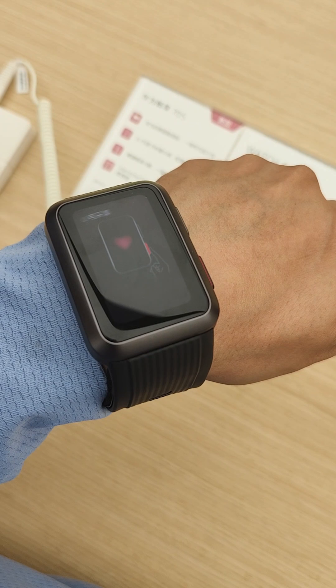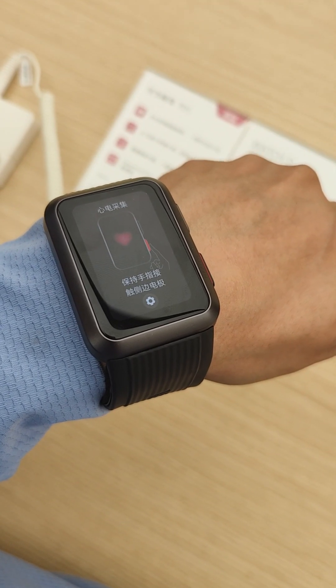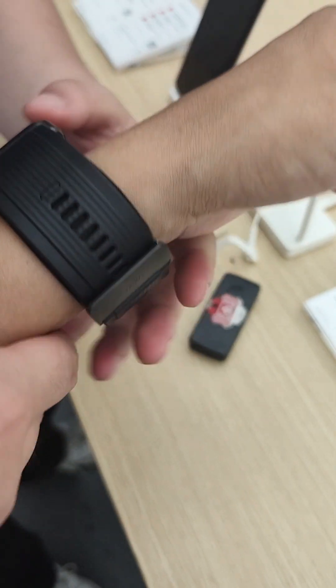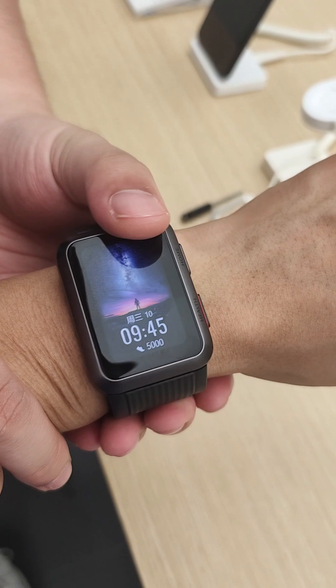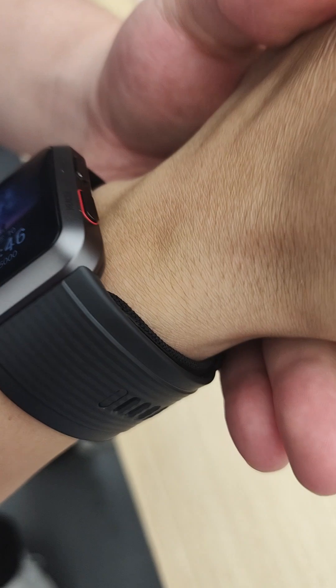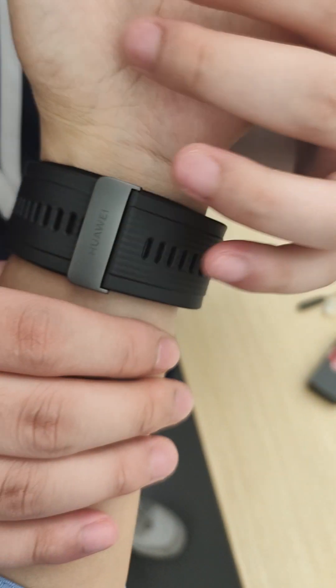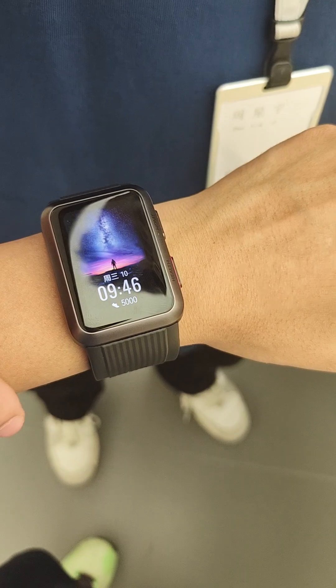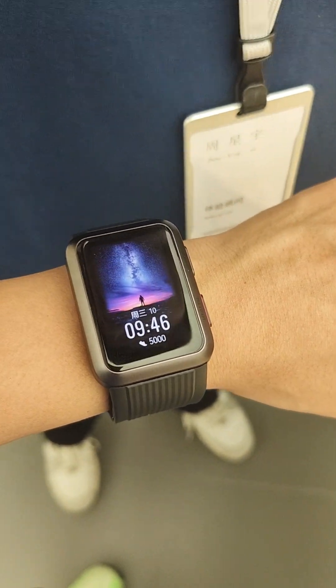Okay, my heart rate is a bit higher. Now let me collect my ECG. I need to keep still — keep still, keep still.